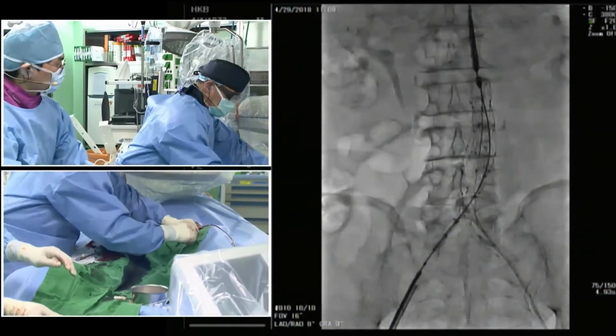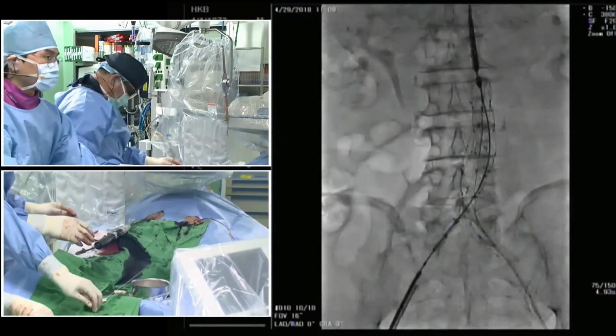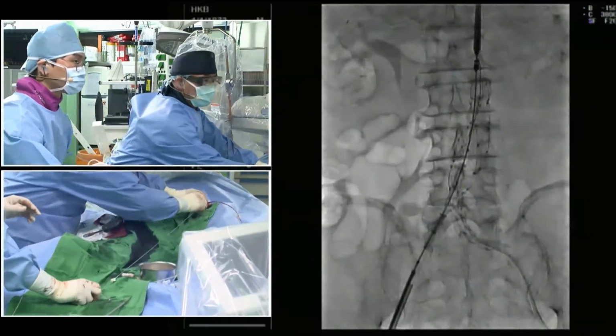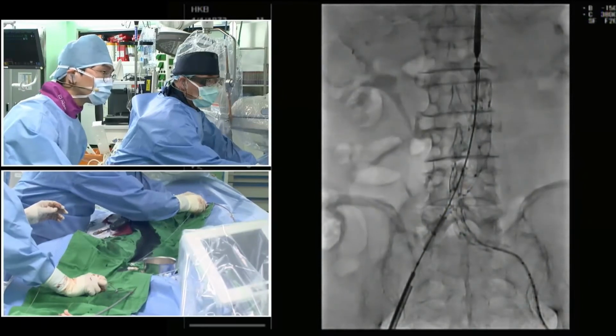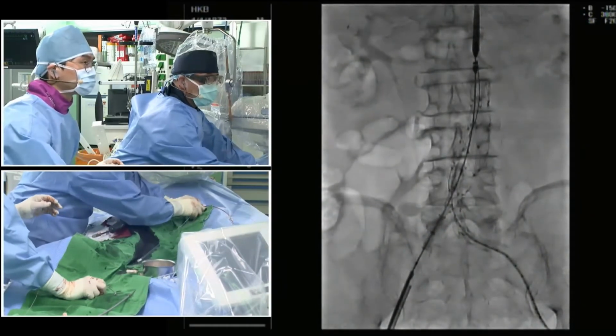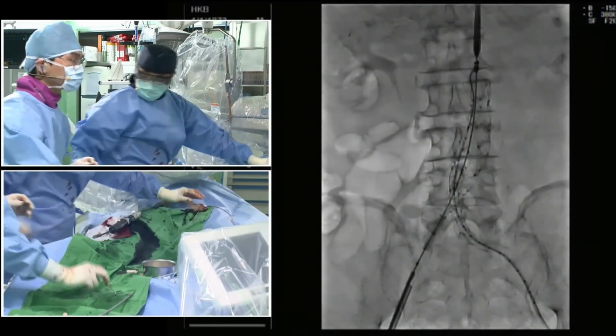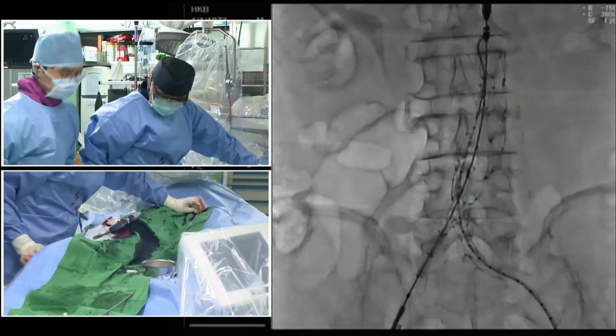Yeah, that limb doesn't really look fully expanded yet, so hopefully it'll pass up without too much trouble. Yeah, you can see it's kind of compressed there. There you go, you made it. Okay, we'll magnify the image.